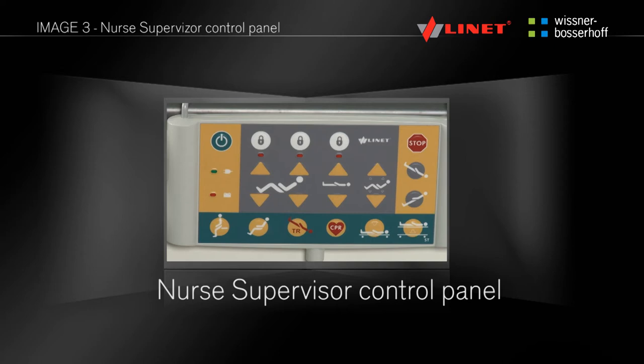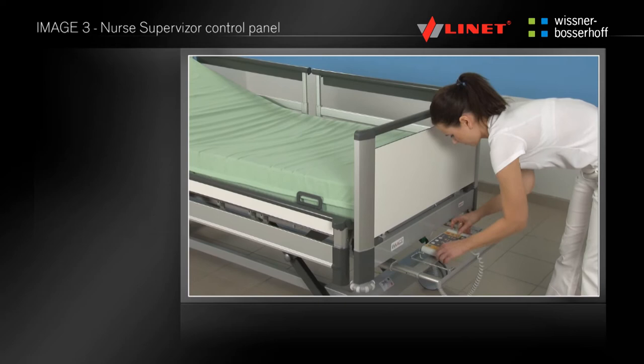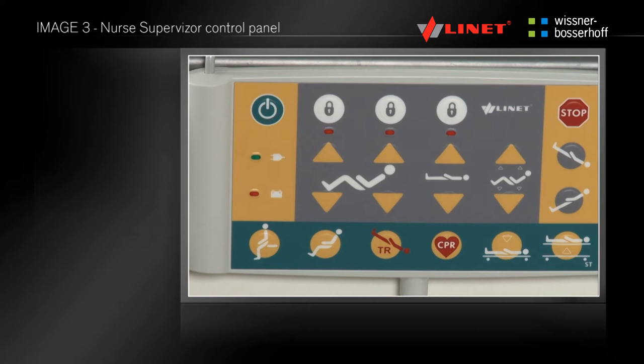For a detailed description of functions, refer to the chapter Electrical Functions of the Bed. You can hang the supervisor control panel on the foot end or place it on the shelf at the foot end of the bed. You start setting the bed by pressing the green go button, which activates the bed for 3 minutes.